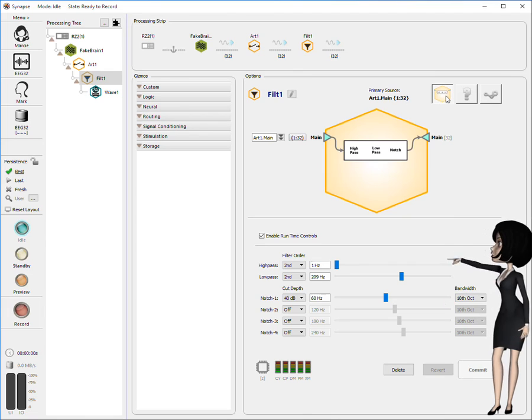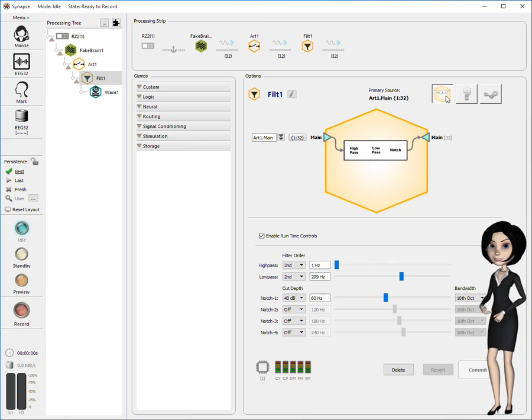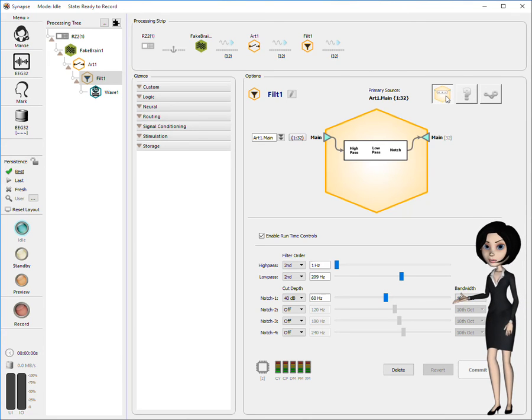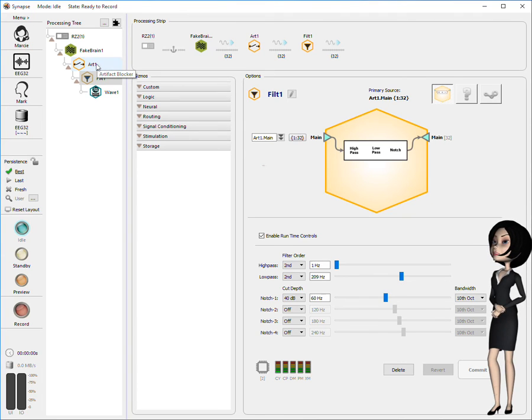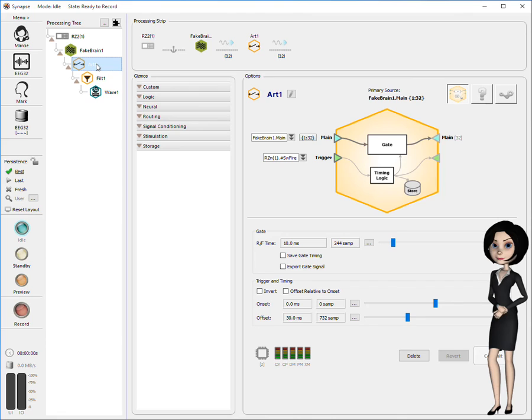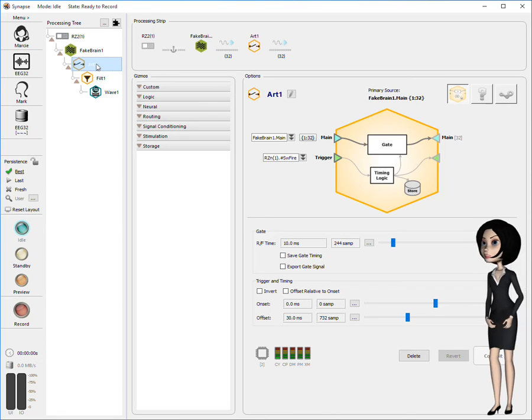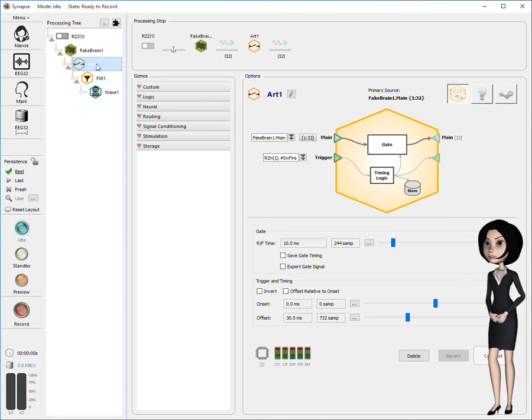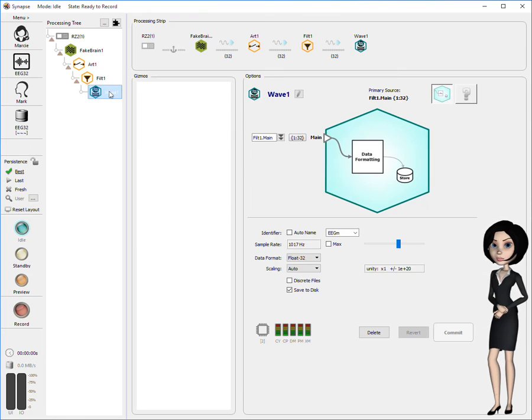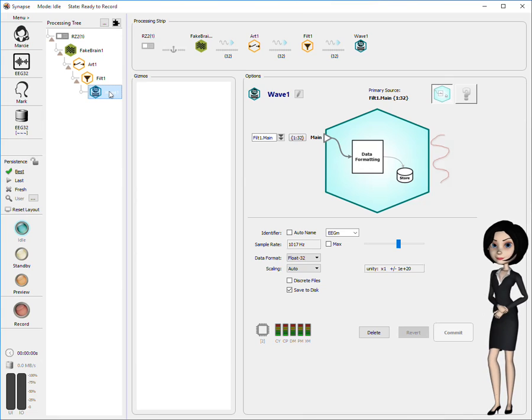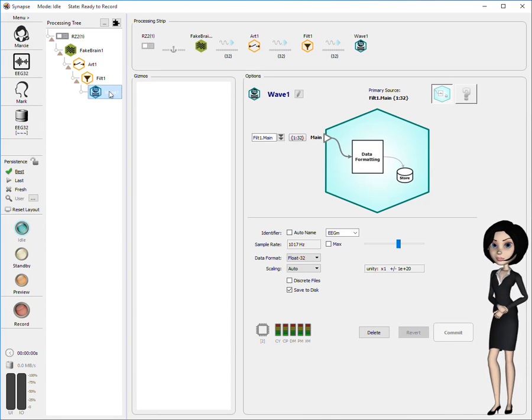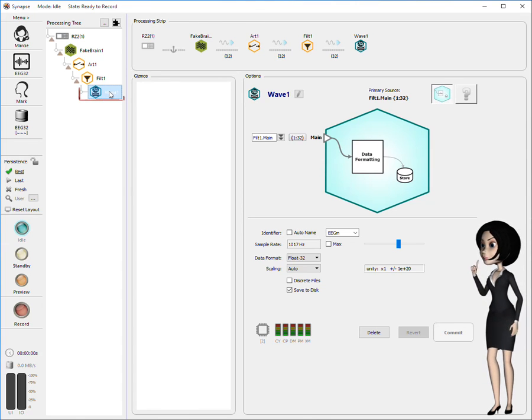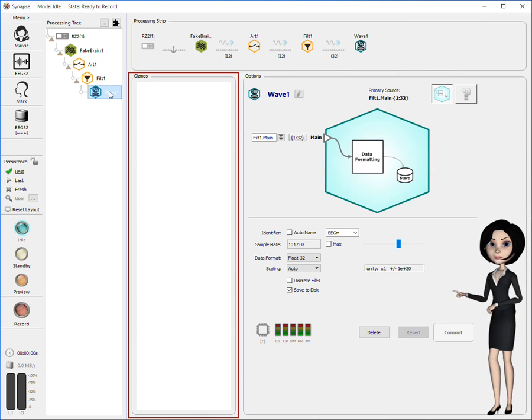The filter gizmo has only one input and one output. Thus no additional information is revealed by the connections panel for this gizmo. The artifact reject gizmo, however, has both a secondary input and a secondary output. I will speak here only about the secondary input and its function. It's worth noting that some gizmos, such as stream store, have no outputs. These are terminal gizmos and nothing can be connected downstream of them. You'll notice that when these items are selected in the tree, no items will be shown in the gizmo selection panel.